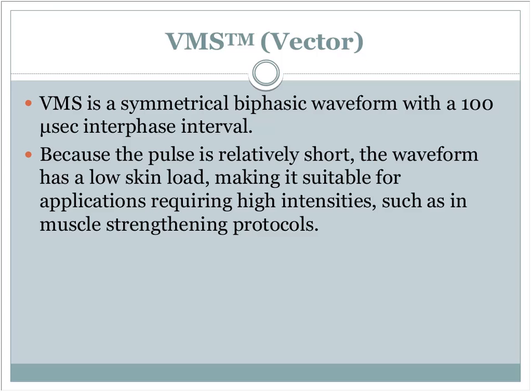As you can see in the title part, it's VMS TM, trademarked. So the Chattanooga group has trademarked this particular waveform, which in all honesty is very similar to a Russian stim. But what all these companies do is they take a waveform and alter it slightly, and then they can call it their own and trademark it.